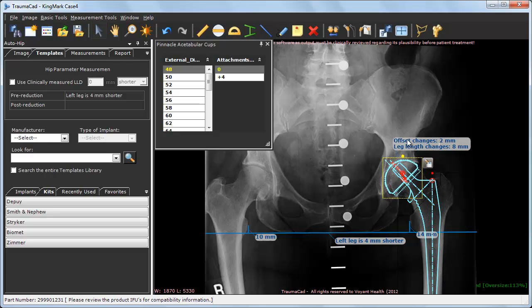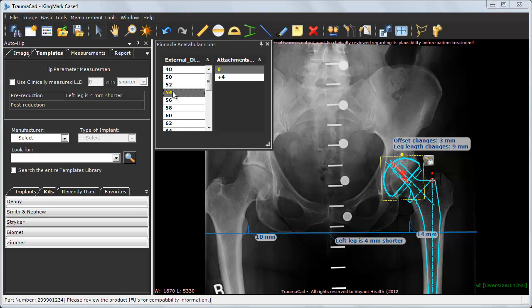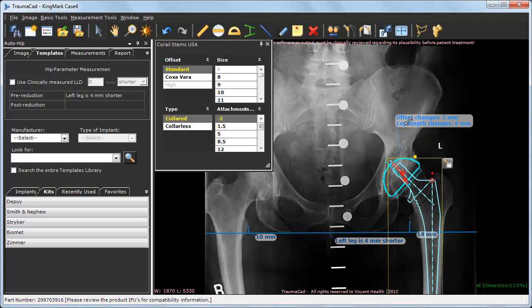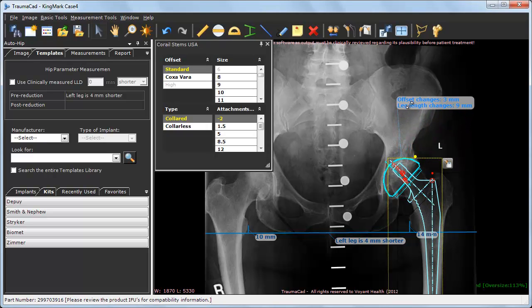At any point, you may adjust any of the objects to move, rotate, or change implant size. The great advantage here is that once the templates are fit to the bones, you can clearly visualize the operation outputs — the predicted leg length and offset changes.